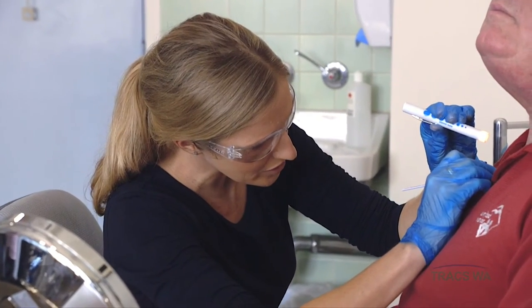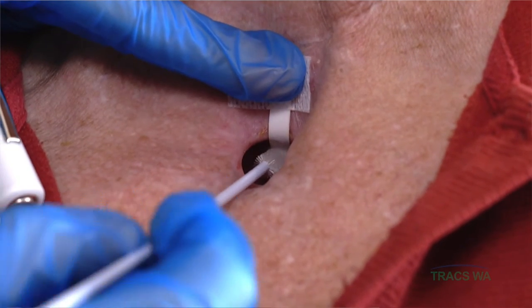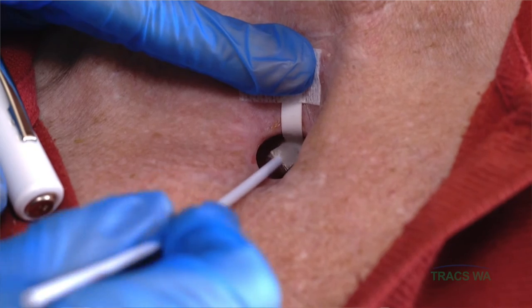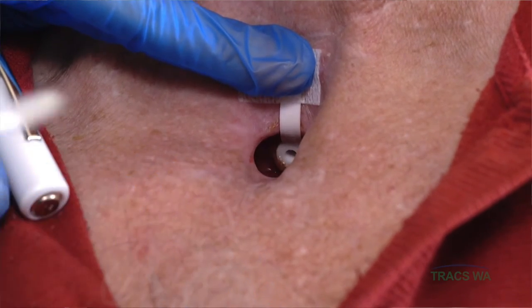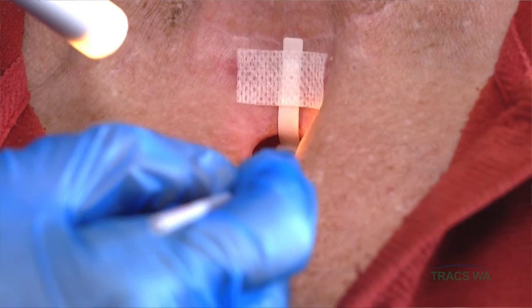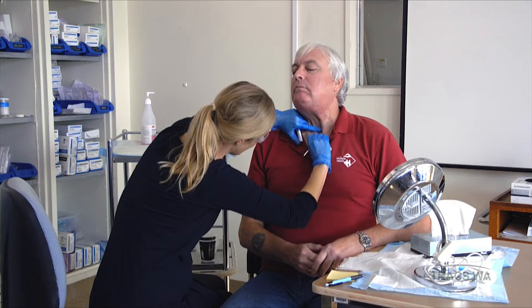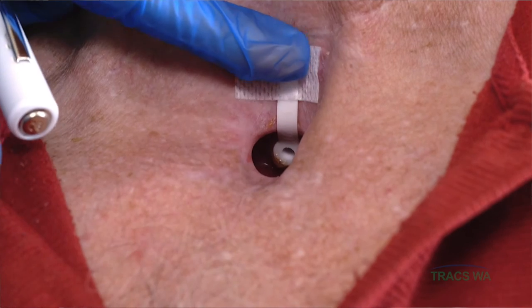I'm just inserting the cleaning brush into the valve about two-thirds of the way in, not all the way through, gently twisting, and I'm supporting the valve on the way out and twisting out gently. You can wet the brush in between times if you're pulling out any mucus or anything like that because you don't want to be putting that back into the valve the next time you go to clean it. I'm going in again, into the middle of the voice prosthesis, gently twisting. It's really important to twist the brush on the way out so we don't accidentally dislodge the valve. Is that okay? Yeah, no problem.